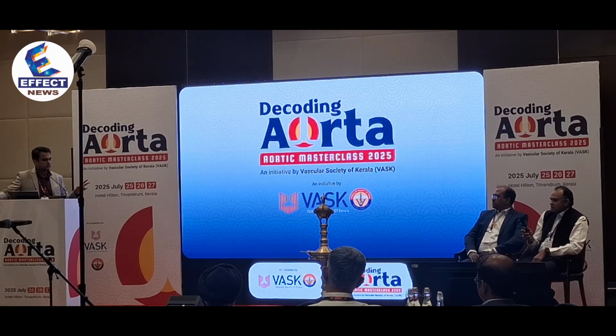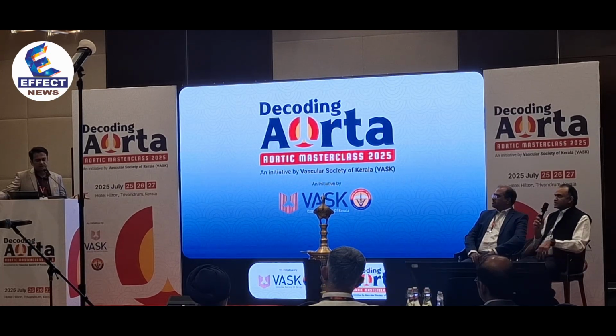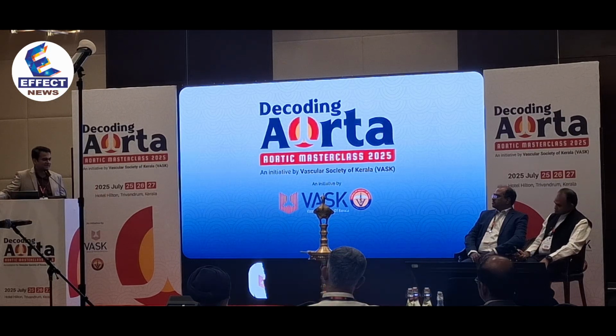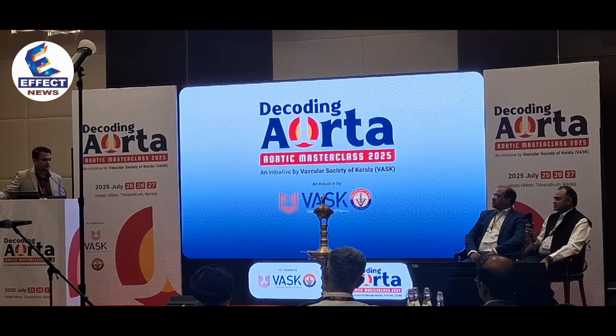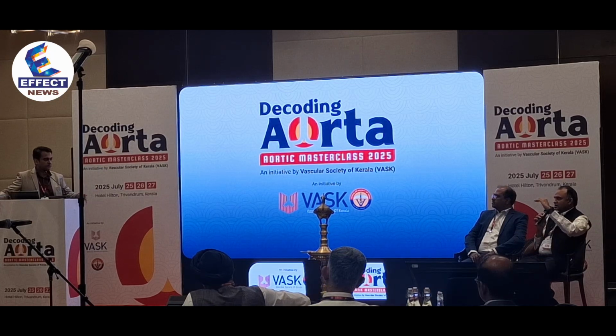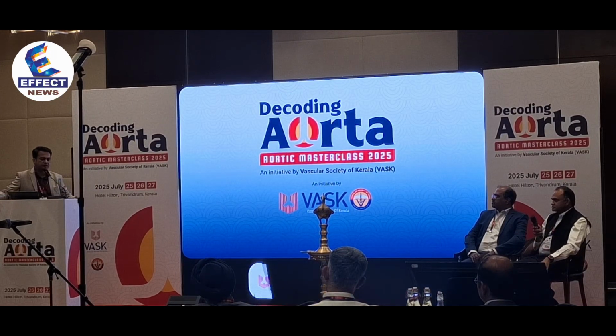Number two was patient comes with a CECT. Yeah. That again, for an open surgery, if a plain CT is okay, obviously CECT is also equally good enough. But in endovascular, of course, you cannot do the plain CT exactly. You want to know exact anatomical detail, so a proper angiogram is required.